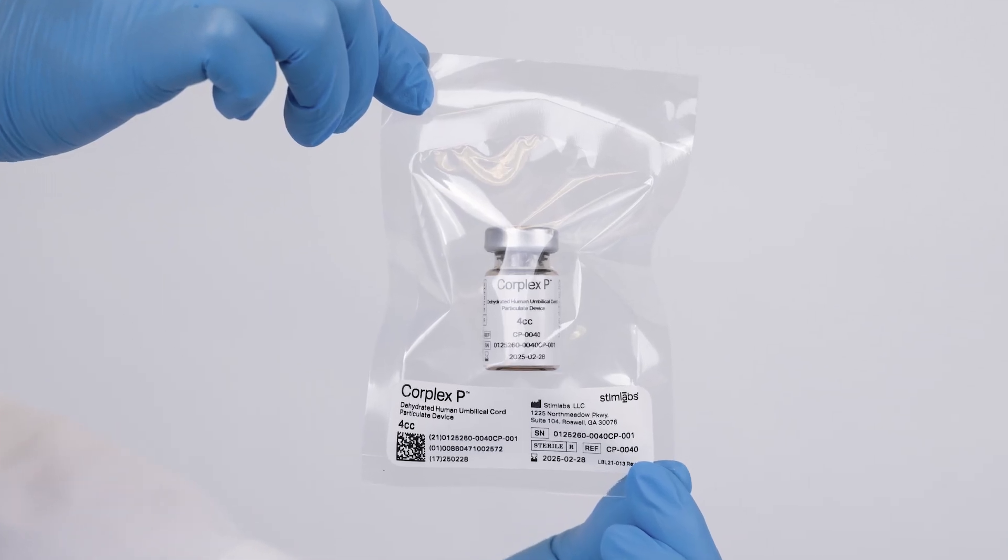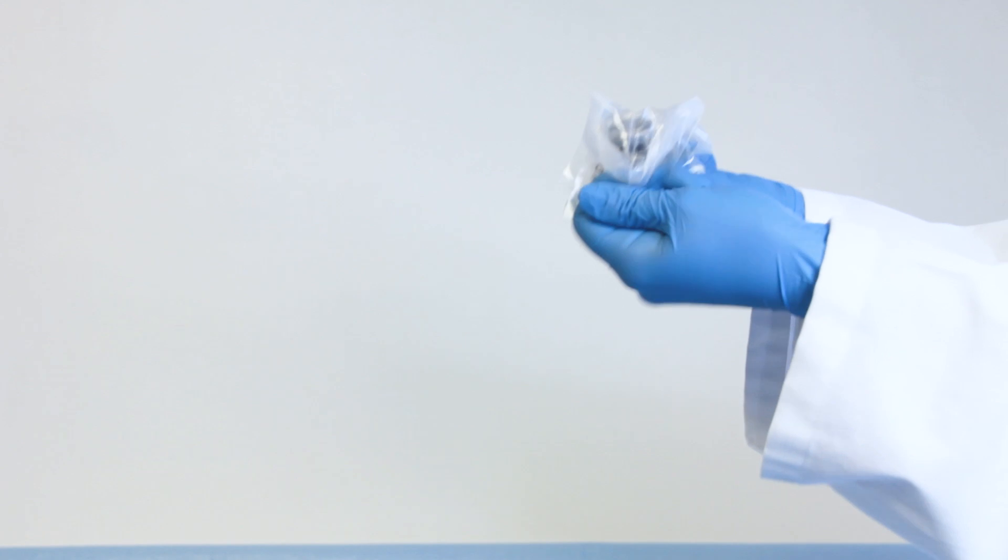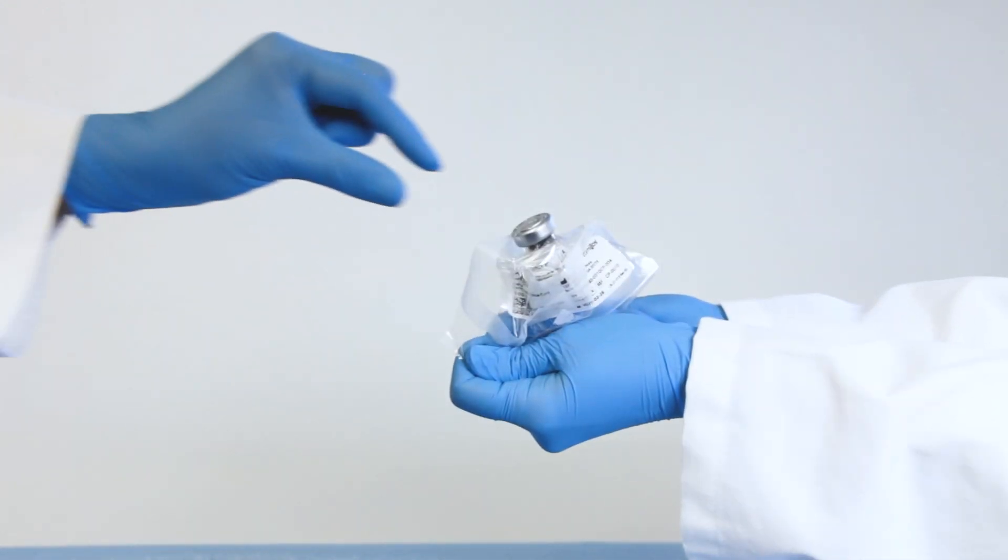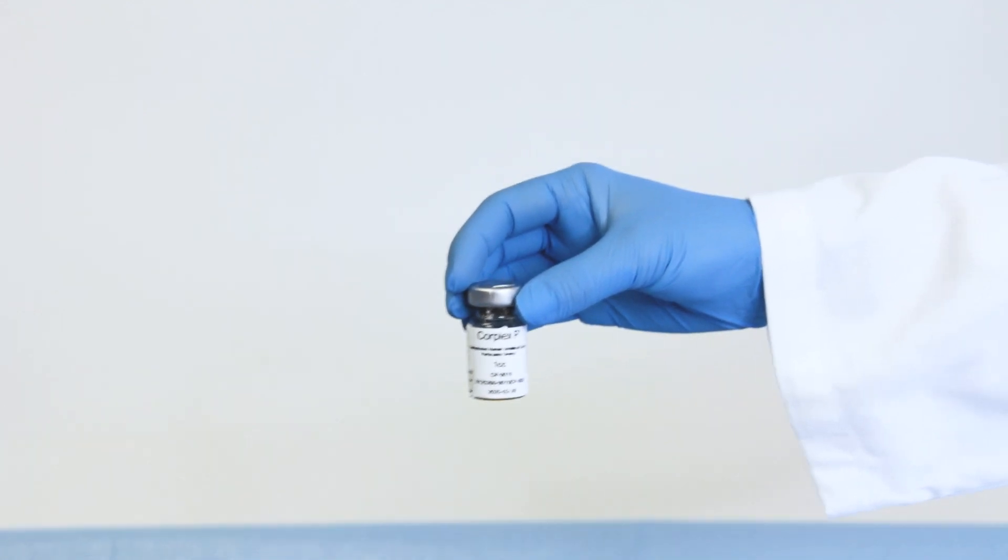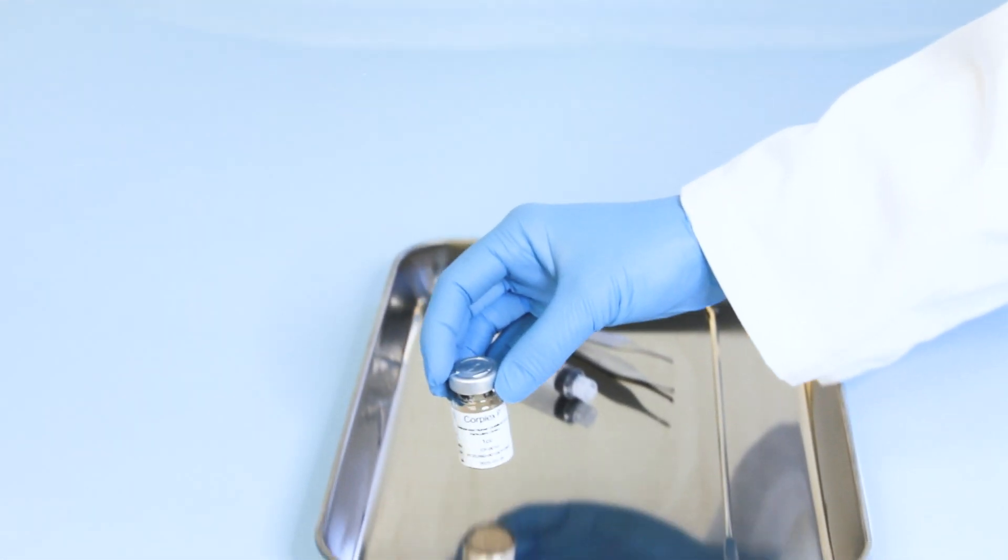Preparing the device. Peel open the pouch using the chevron opening and remove the sterile CorPlex-P vial using aseptic technique. Once the pouch seal has been compromised, the device shall either be transplanted, if appropriate, or otherwise discarded.